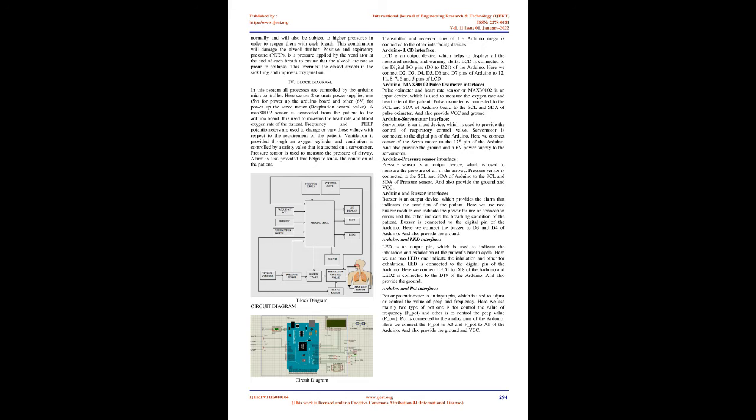Inspiratory, expiratory ratio. Inspiratory, expiratory ratio refers to the ratio of inspiratory time to expiratory time. In normal spontaneous breathing, the expiratory time is about twice as long as the inspiratory time. This gives an IE ratio of 1:2 and is read 1 to 2. The total time of a respiratory cycle is determined by dividing 60 seconds by the respiratory rate. Inspiratory time and expiratory time are then determined by portioning the respiratory cycle based on the set ratio.